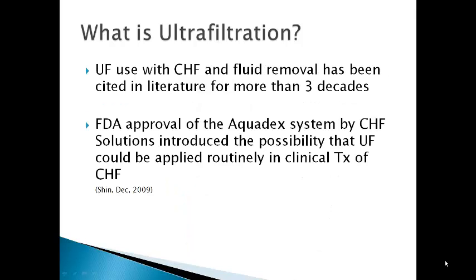UF use with CHF and fluid removal has been cited in literature for more than 3 decades. However, the FDA recently approved the Aquadex system by CHF Solutions and introduced the possibility that UF could be applied routinely in clinical treatment of CHF.